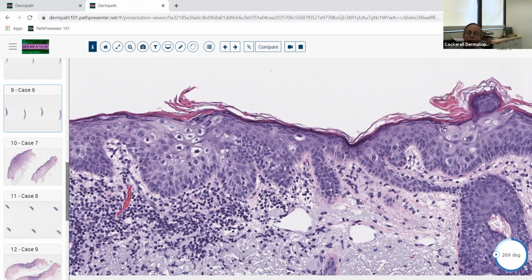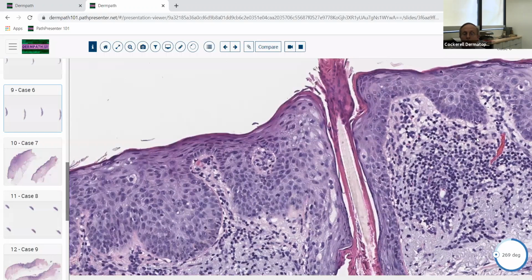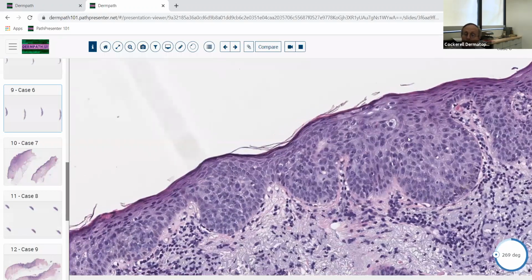And if this were to go on over a broad front, we might go ahead and call it a squamous cell carcinoma in situ that's arisen from an actinic keratosis. So the criteria that we use is the diffuseness of involvement, whether it's involving follicles, here you're getting a little bit of follicular involvement, and if there's any acanthosis. So here you can see it's beginning to form what looks like maybe squamous cell carcinoma in situ arising from an actinic keratosis.